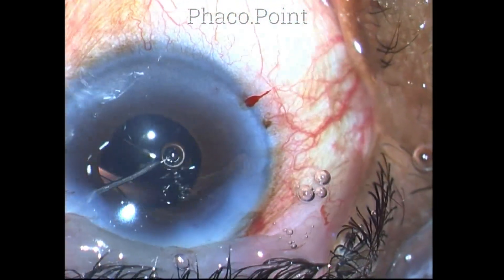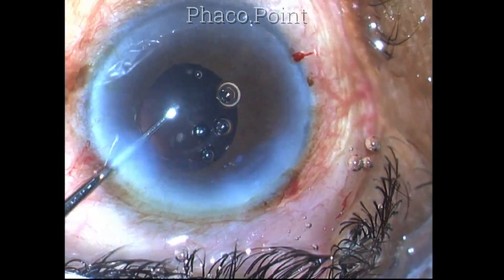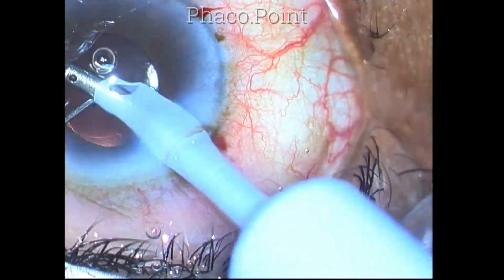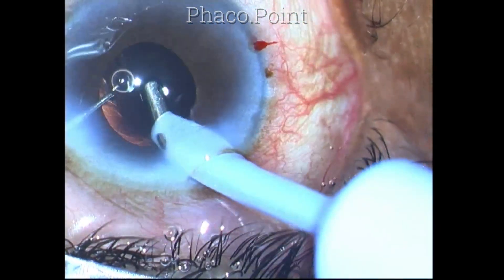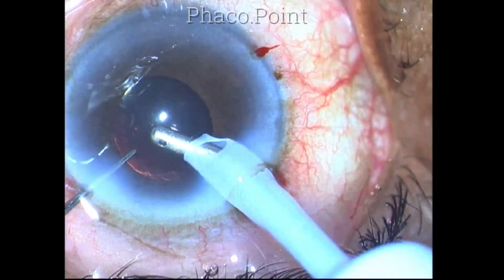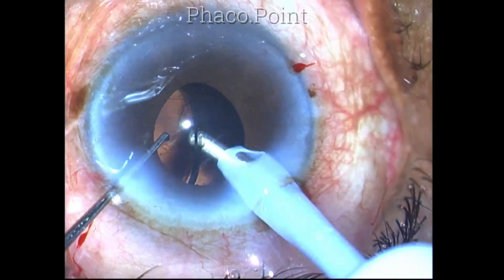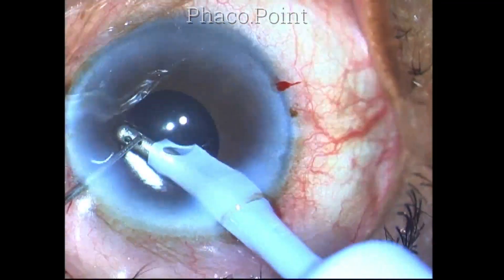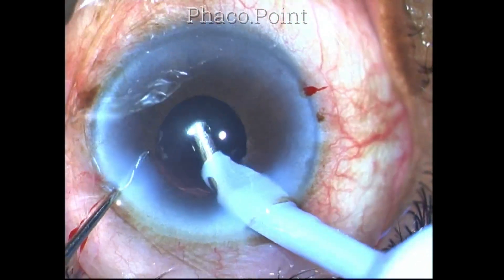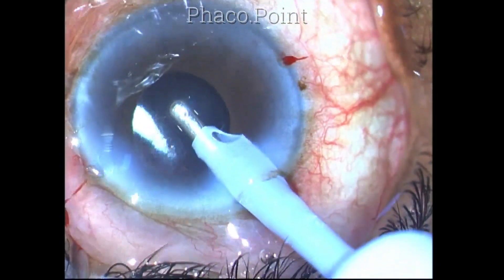Finally, a hydrophobic acrylic single-piece intraocular lens is injected within the capsular bag. The whole procedure on a very hard cataract has been done using just the direct phaco chop technique and methylcellulose only. After washing out all the viscoelastic, the clear corneal incision is secured and the case is completed.